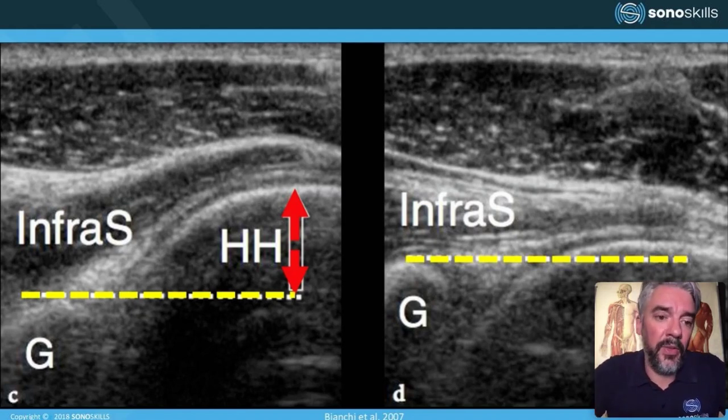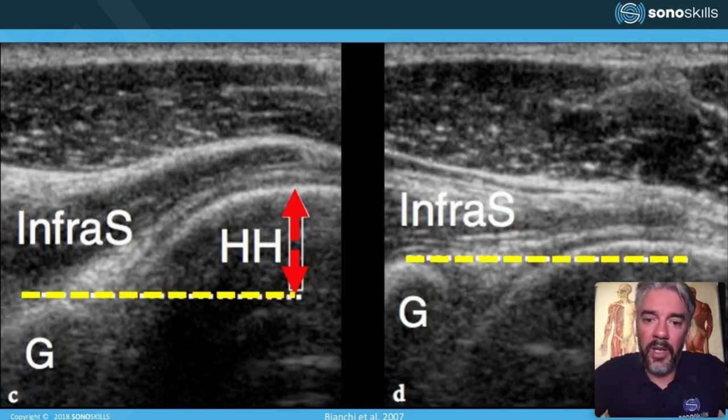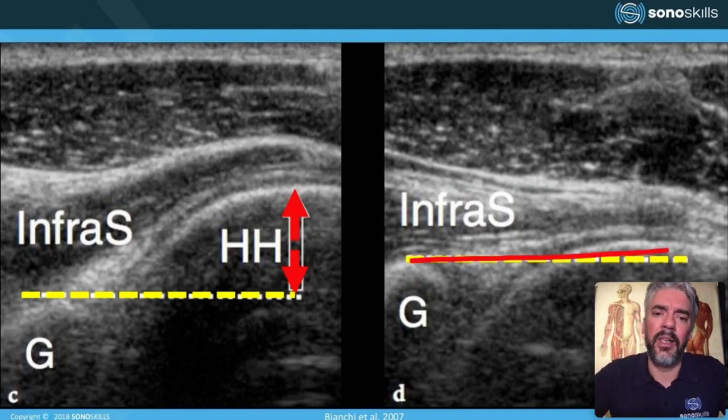And this is what I mentioned about the dislocation of the humeral head. So in this case, you can see that it's normal, the distance between the top of the humeral head and the top of the glenoid cavity. And if there is a different position, suddenly these two align, and this should not happen. And typically you would see that suddenly this infra is becoming really bright. So that's the first thing you would notice.